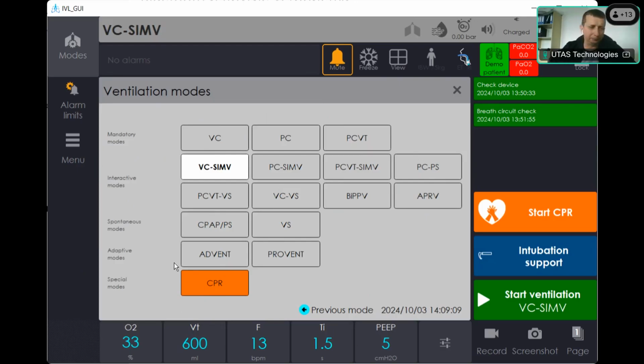Glasgow coma scaling. Yeah, scale. Because the ventilator can adjust according to the condition of the patient or something like this. No. Look, this Glasgow scale is based on physical examination by the doctor, and the ventilator cannot perform this examination in spite of the doctor. The doctor is scaling a patient according to this scale, analyzing the results of the examination of the patient's consciousness.